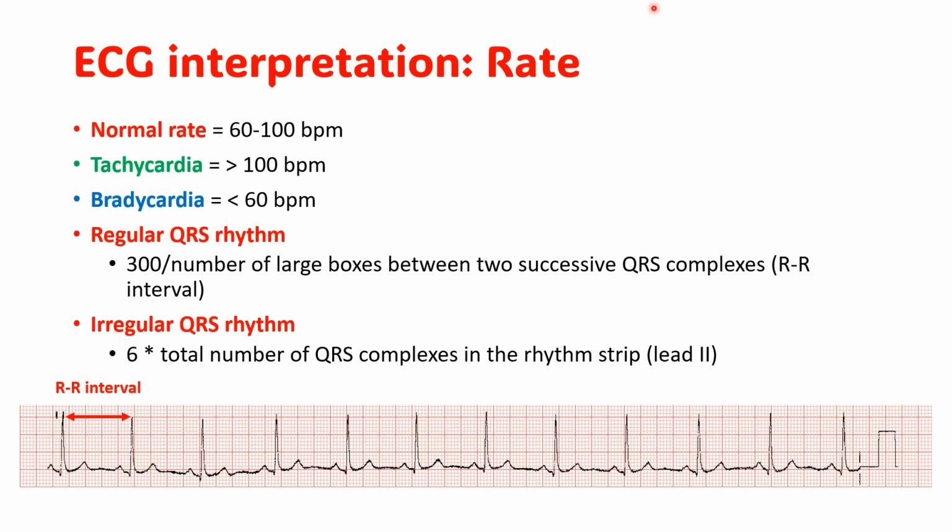I mentioned this in my video about atrial fibrillation, where that's called a rapid ventricular response, where we tend to have a high ventricular rate in response to a high atrial rate.